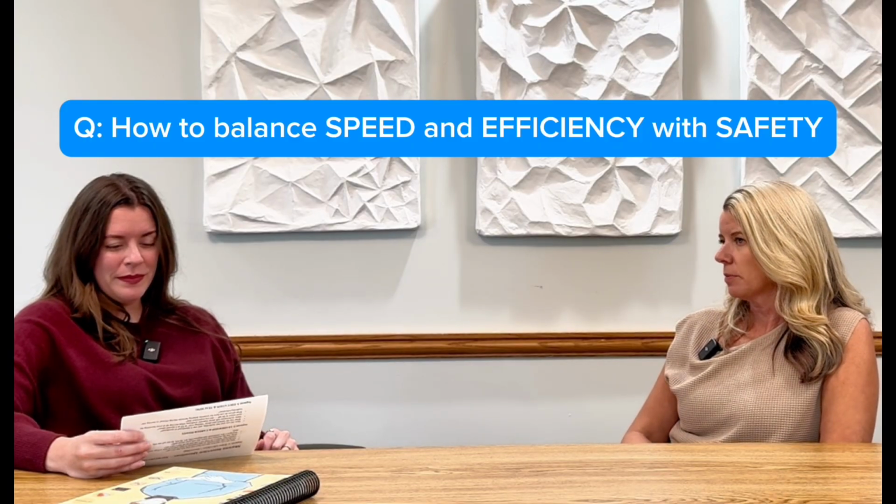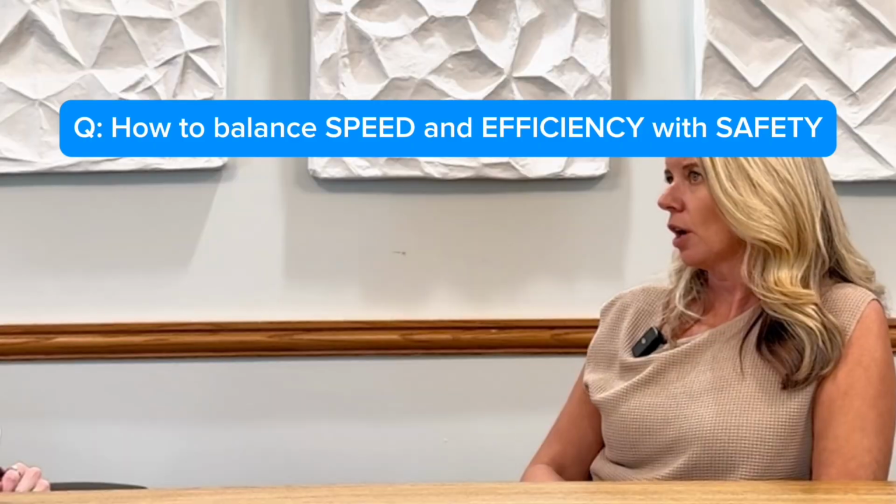A lot of it is muscle memory, but you also have to know where is your emergency equipment. What do we do? What's first? What's second? Prioritization. You need to be confident enough to know where your equipment is, what you need for what complication, and be able to turn on a dime. You're not going to be competent if you haven't sought those things out, because remember, complications don't happen that often. So you have to kind of mentally go through those things.